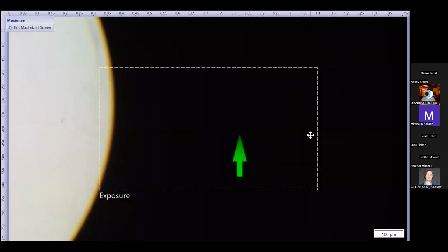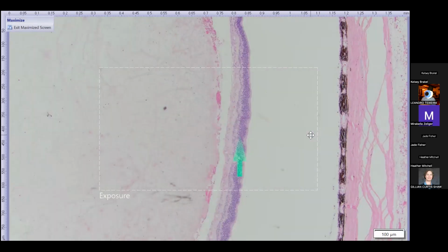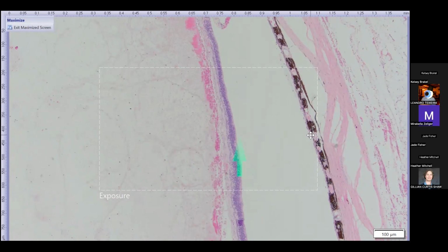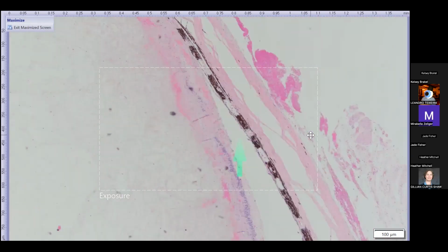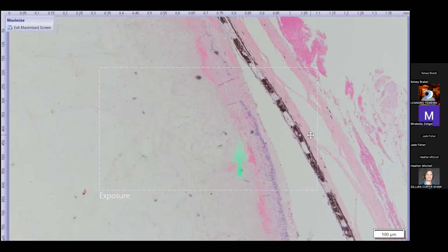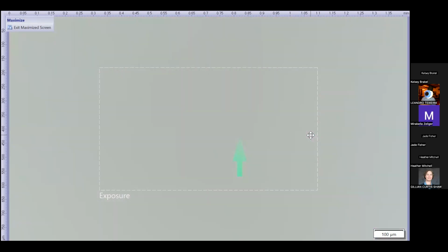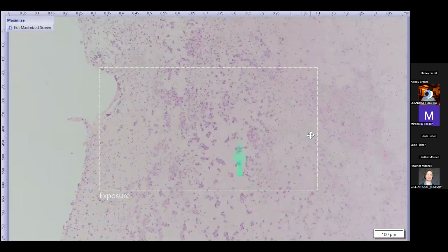And then let's see what the back of the eye looks like. Oh, that's right. This is the deeper section without the optic nerve head. Here, the retina becomes completely necrotic, which is probably associated with the intraocular inflammation. So I just wanted to show one of the other deeper sections to show you some organisms that are in the lens.